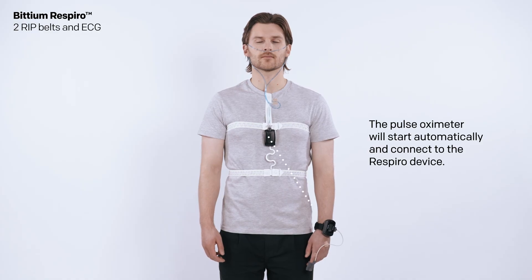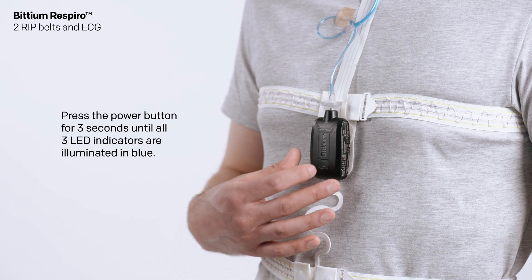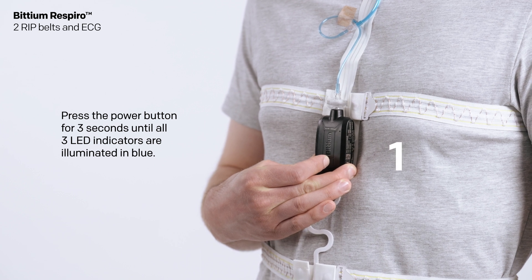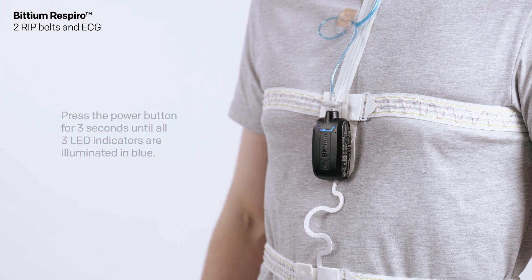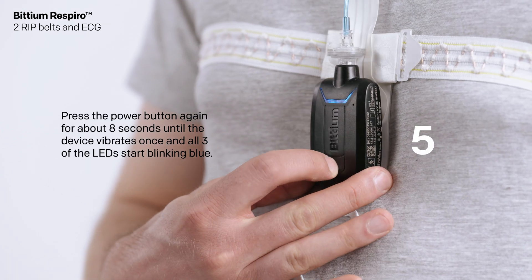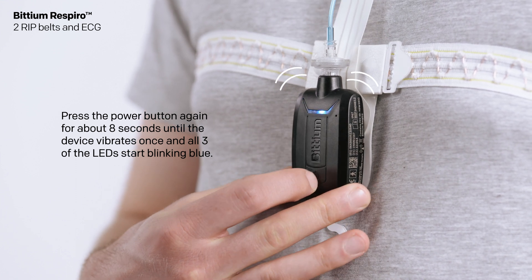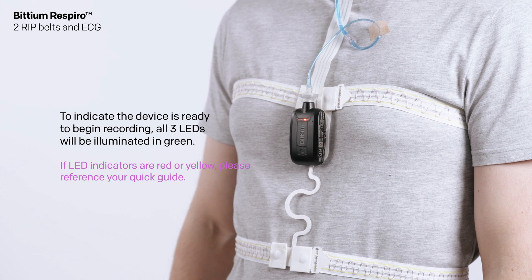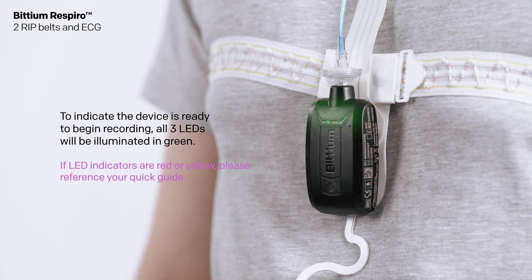The pulse oximeter will start automatically and connect to the Respiro device. To start the recording, press the power button for three seconds until all three LED indicators are illuminated in blue. Press the power button again for about eight seconds until the device vibrates once and all three LEDs start blinking blue. To indicate the device is ready to begin recording, all three LEDs will be illuminated in green.